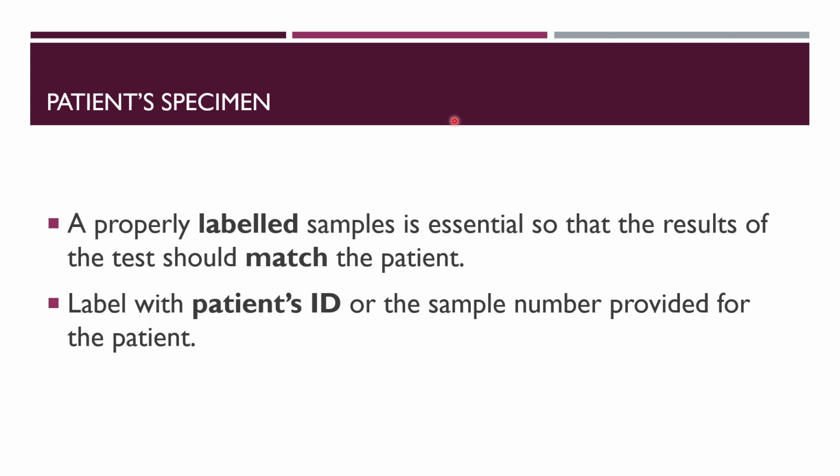So you should also mention a few other things along with the name, such as parameters like age and surname. So now there are three parameters: name, surname and age. Along with this, you can also mention the test names, which is a common procedure used in a small scale lab. When we talk about medium scale or large scale laboratories, they follow a barcode system.